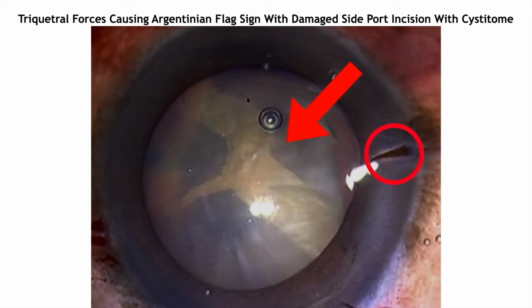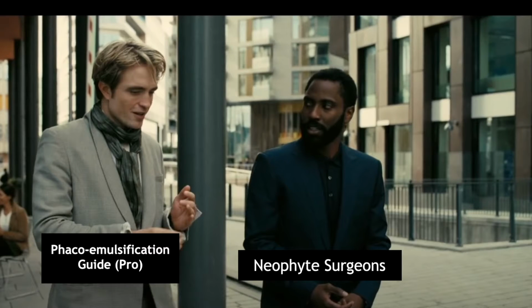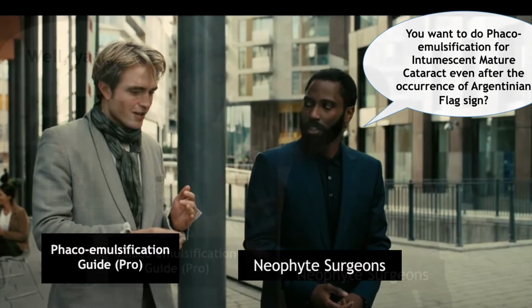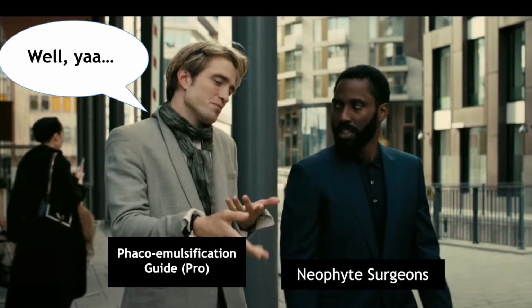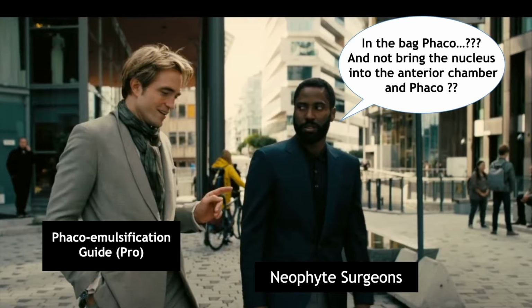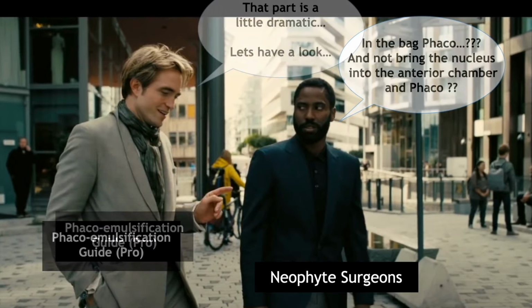The novice surgeon had so many questions in his mind, such as, "You still want to proceed Phacoemulsification for this intumescent mature cataract even after the occurrence of Argentinian flag sign?" "Well, yeah," was my response. The next question that popped was, "In the bag phaco, or do you want to bring the nucleus into the anterior chamber and do phaco?" Well, that part is a little dramatic.